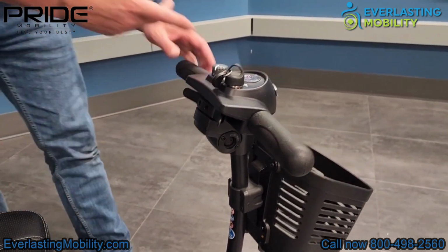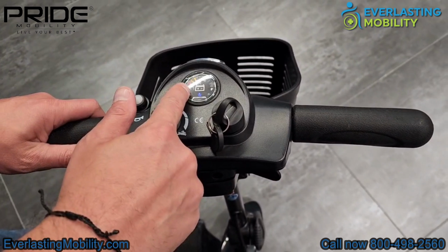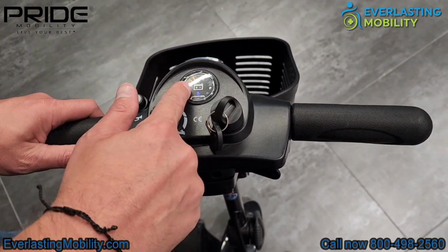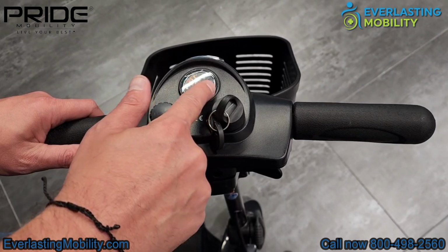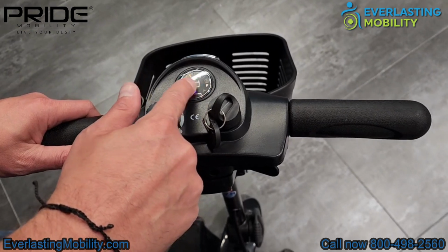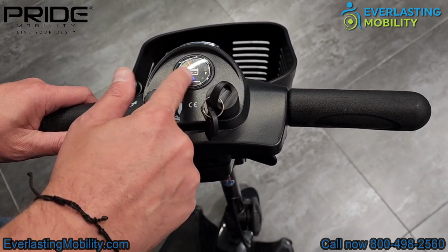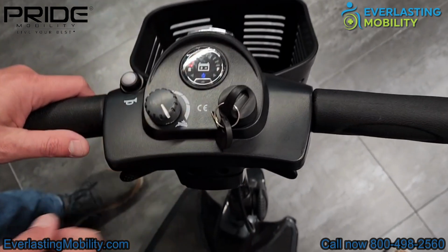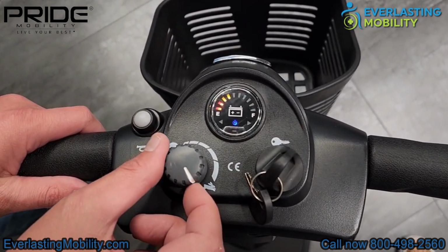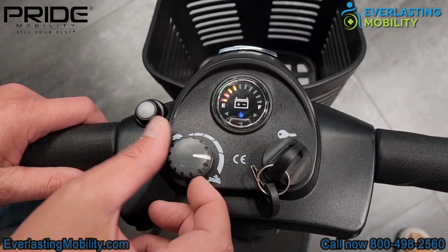Now, speaking of the tiller, we'll show you a few features. So this is the battery gauge. Once it's fully charged, all of these bars will be lit up. Once it gets down to about halfway charged, or maybe a quarter of the way charged, if you charge the batteries at that time and get in the habit of doing that, that will increase the longevity and lifespan of your batteries. This is your speed control dial. If you turn it all the way to the right towards the rabbit, then your max speed is around 4 miles per hour.